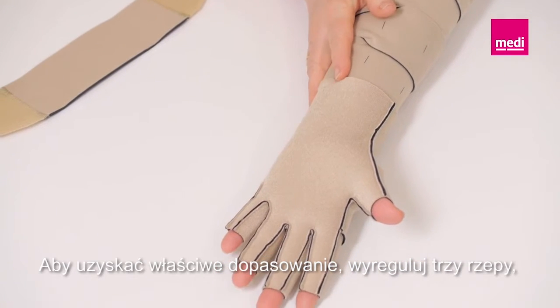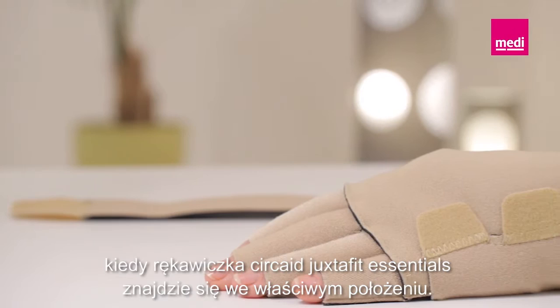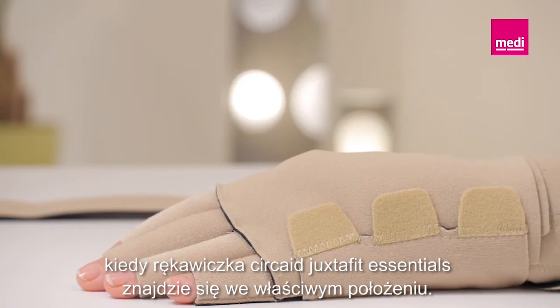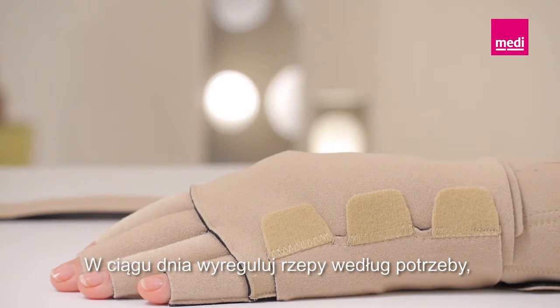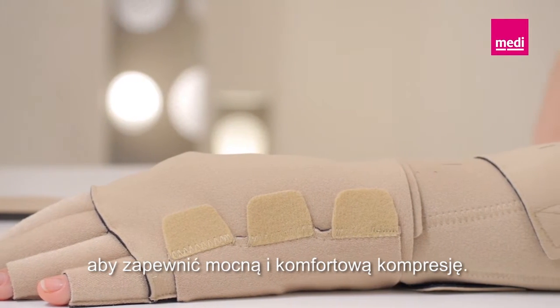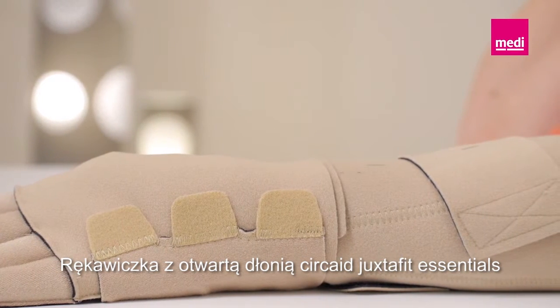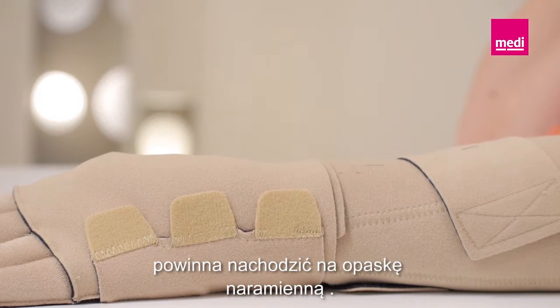For a snug fit, readjust the three Velcro tabs once the Circade Juxtafit Essentials glove is in place. Readjust the tabs as necessary throughout the day to maintain a firm and comfortable level of compression. The Circade Juxtafit Essentials open palm glove should overlap with the arm sleeve.